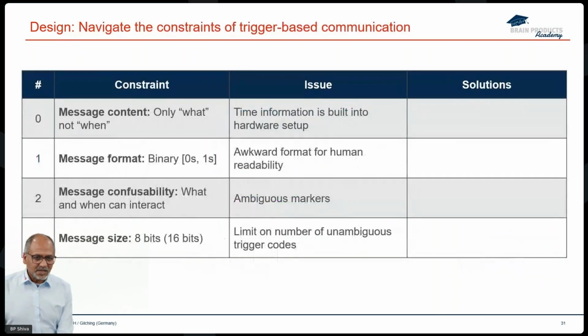What makes filling out this trigger plan sometimes tricky is that there are some constraints, and I mentioned three of them, and I'll go through them step by step.